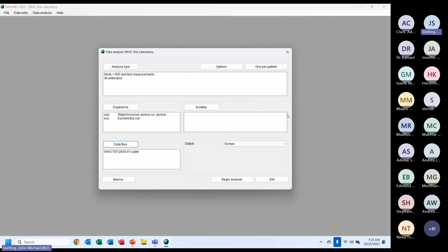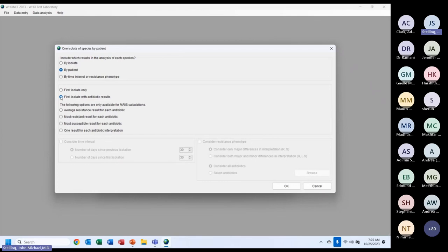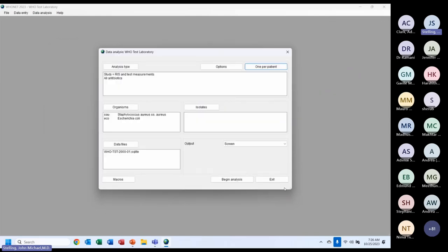Those are my three core analysis details. I can now click Begin Analysis, but first I want to go to the 'one per patient' feature — specifically 'first isolate with antibiotic results'. This will be discussed in our January or February webinar on antibiogram preparation. For today, I choose first isolate with antibiotic results, click OK, and I'm now ready to begin my analysis.